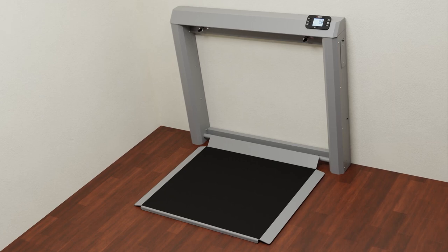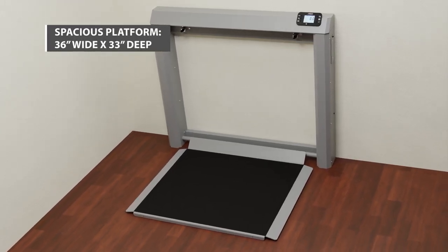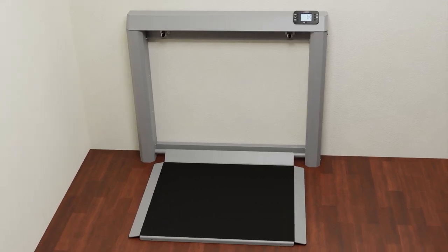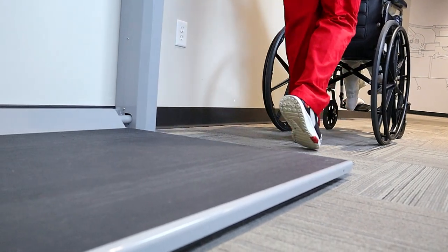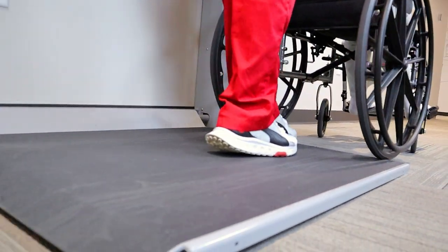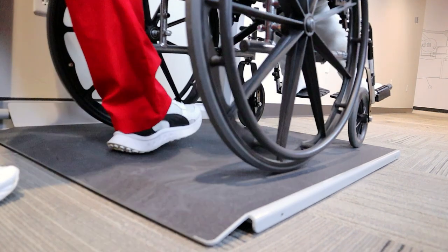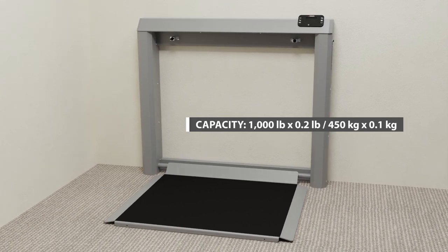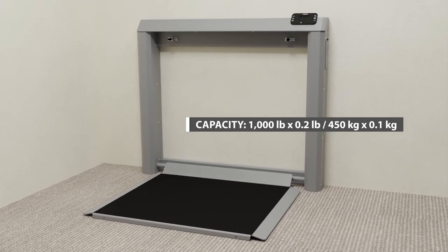The 7550 offers a spacious weighing platform that is 36 inches wide by 33 inches deep (91 centimeters by 84 centimeters), providing ample room for a variety of wheelchair sizes and types including most power wheelchairs. The 7550 can capably accommodate bariatric patient weights with its high capacity of 1000 pounds (450 kilograms).